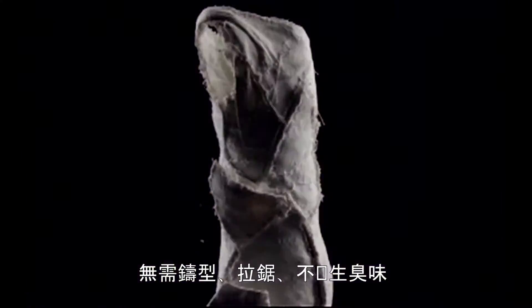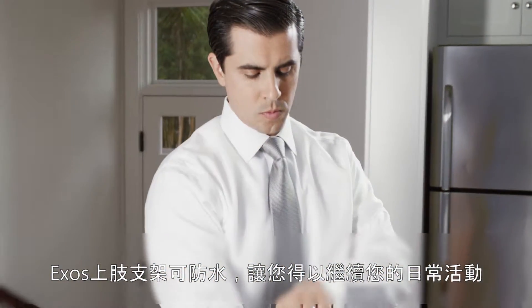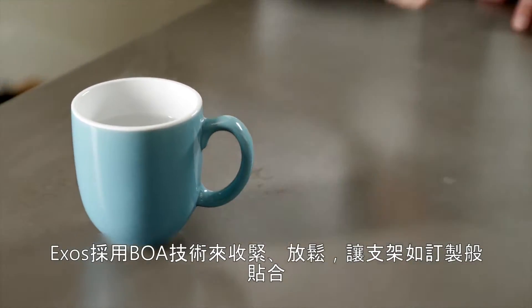No casts, no saws, no itchy, smelly mess. Exos upper extremity braces are waterproof so you can enjoy your daily activities. Exos uses BOA technology to tighten, loosen, and provide a more custom fit.